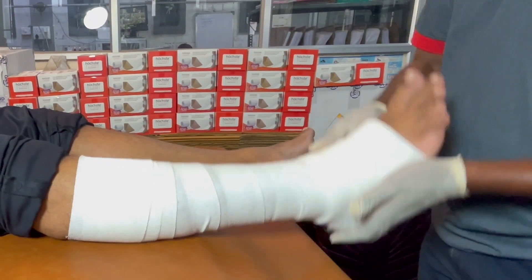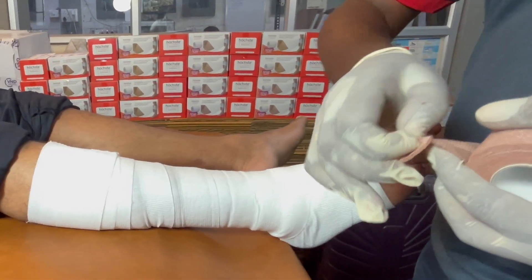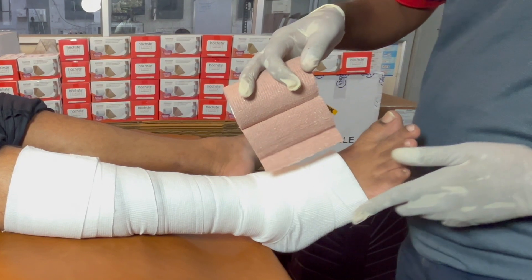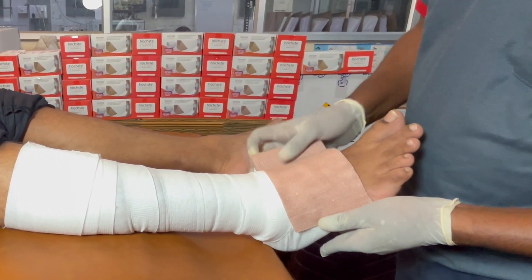Apply light pressure at the end of the bandage and confirm it throughout. Now for application of the second elastic cohesive layer: keep the leg in the same position and start the application of the compression layer in the same fashion, starting from the 5th metatarsal toe.